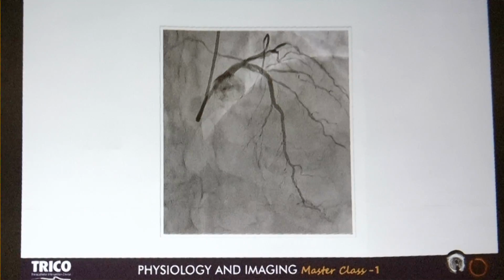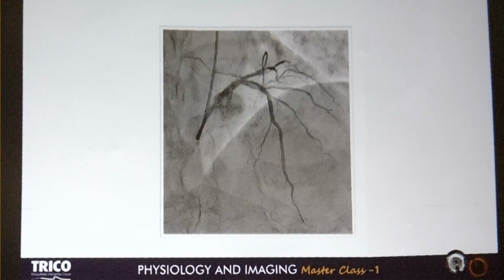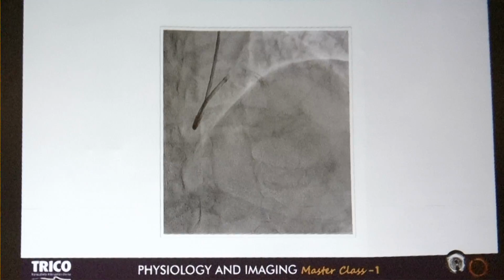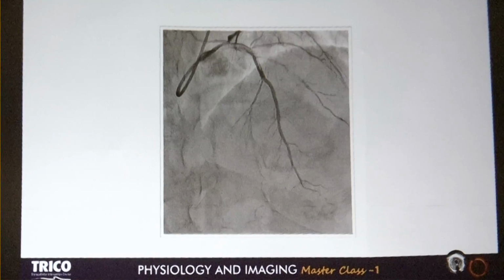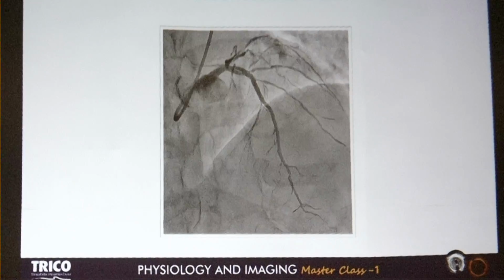False lumen? How can there be a false lumen? It is not a false lumen. It is a true lumen somehow only. Did you stent through? It is stent malposition, a non-expanded stent. But why is the stent non-expanded? Because of severe calcification.